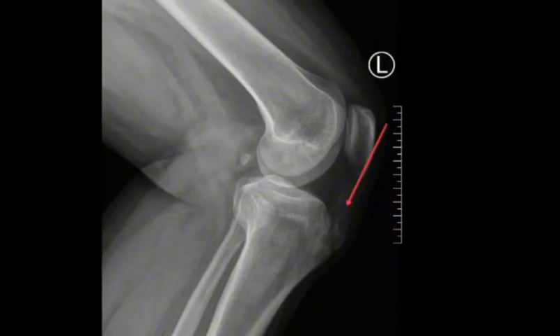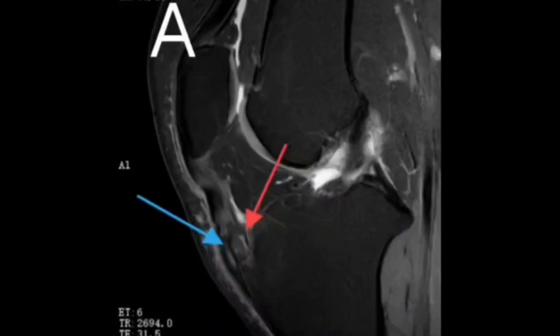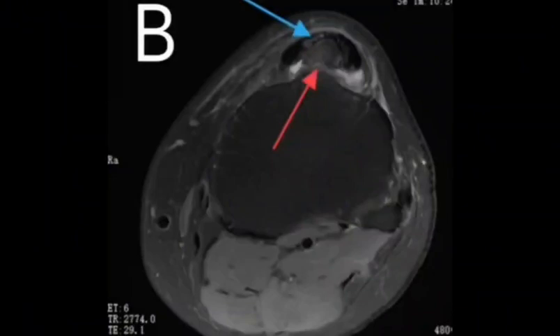X-ray, CT, and MRI are used to clarify the patient's condition. From the imaging pictures, we can see the tibial tubercle osteophyte and damaged tendon. Urate crystals cannot be detected through regular imaging examinations, so we opt for arthroscopic exploration.